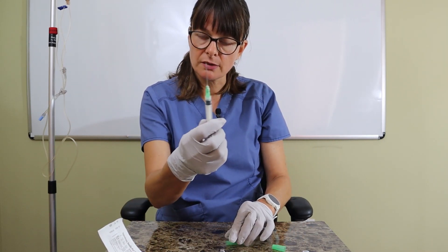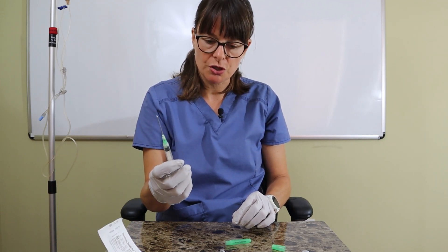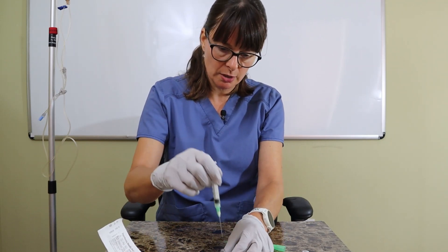This is a large 18 gauge needle so I want to take safety precautions. Usually with a vial we insert air first, but I don't want to insert any air into this ampoule because there's no rubber stopper to keep it pressurized. So I can just insert the needle and draw it up.